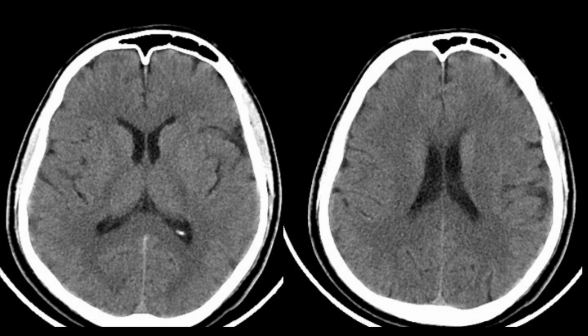The key takeaway here is this: coil embolization of the middle meningeal artery alone, without using particles, can be safe and effective. This approach is supported by emerging literature, and we will be discussing those articles in future episodes.